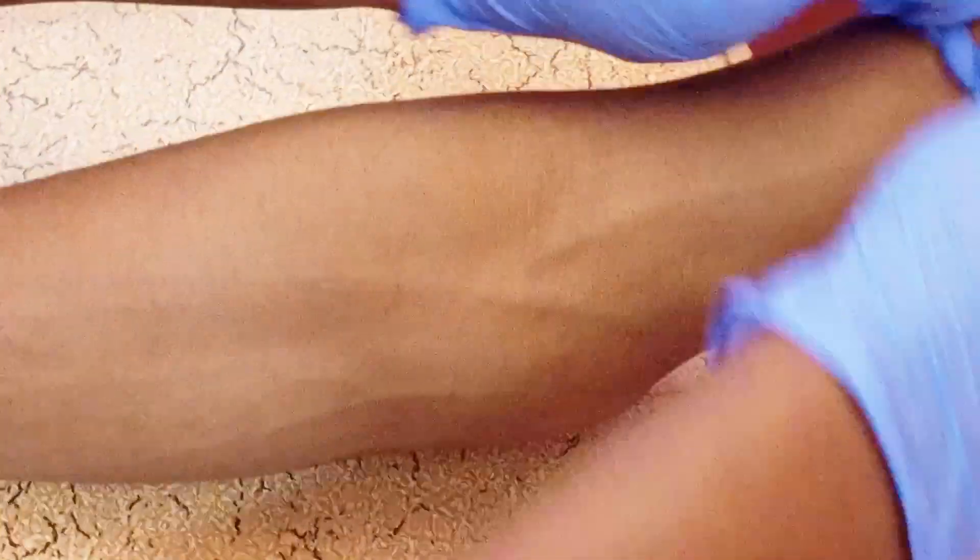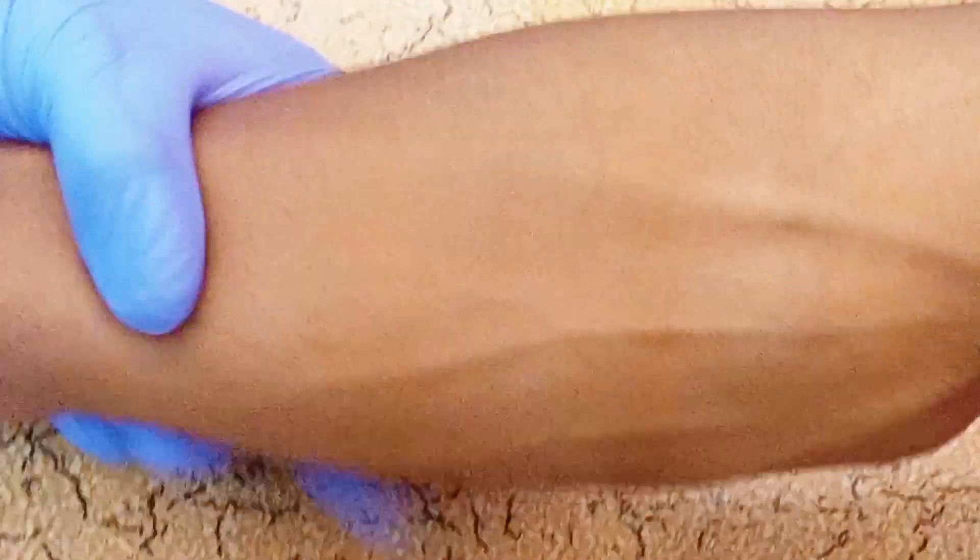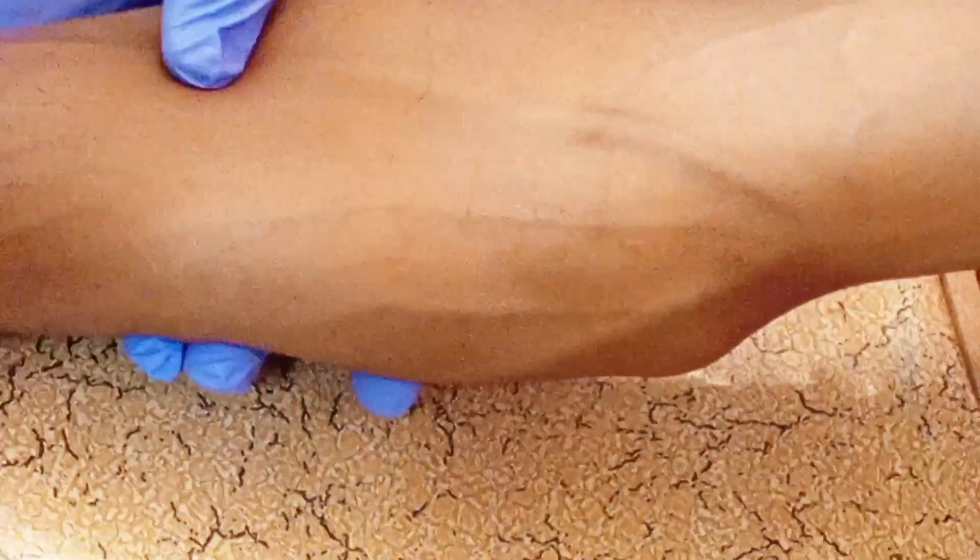First, let me tighten the tourniquet. You bilbit the hand first, then you get an alcohol swab and apply it gently. Now we want to find the best and most suitable vein to take blood from.